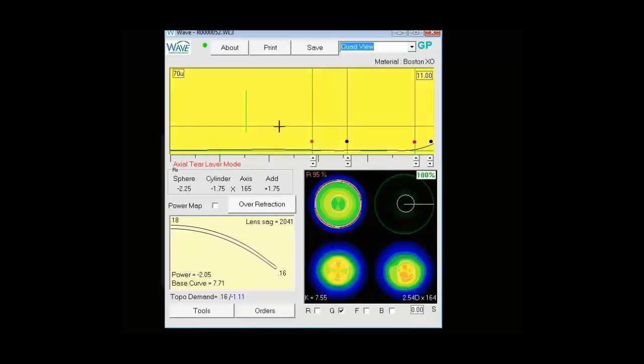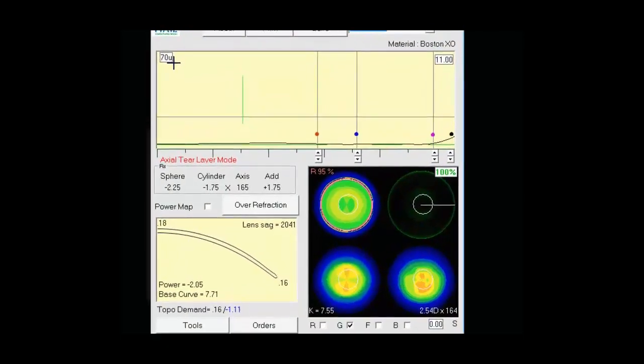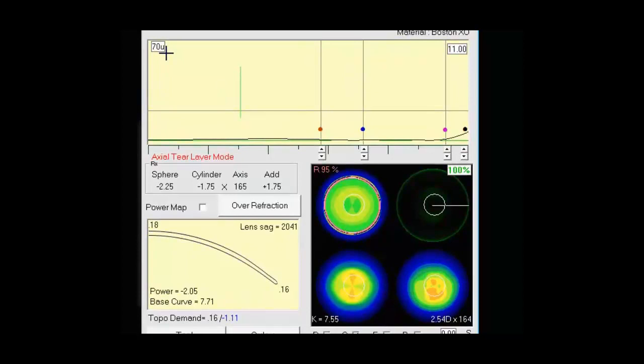Next, we'll move into the tear layer clearance display, which is this big box in here. On the upper left, you'll see an indicator that shows 70 microns. That's the depth between the base of the cornea, which is down here, and the top of this display screen.